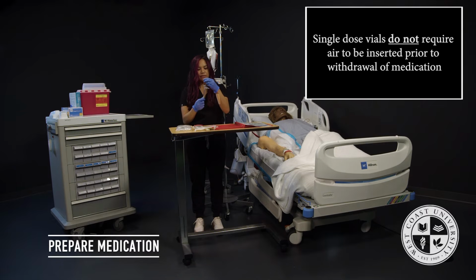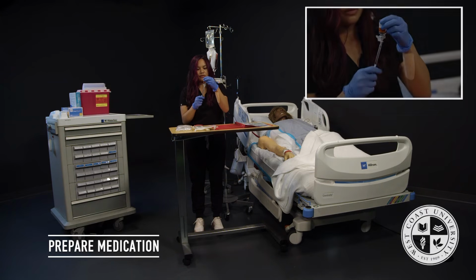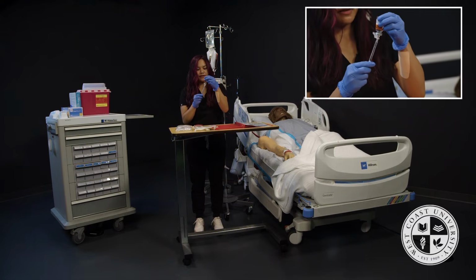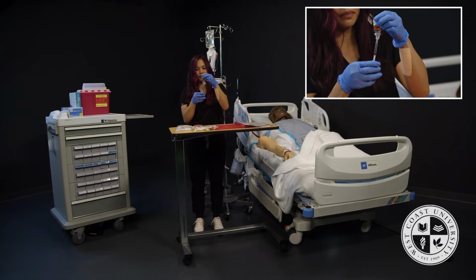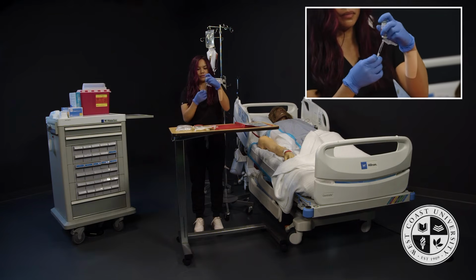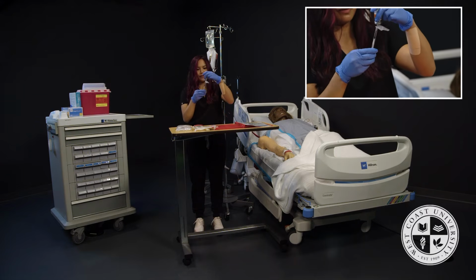Since I have completed my Med Check 3, I'm going to use this time after I draw up the medication to call for a second RN to verify. I'm going to make sure I get all the air bubbles out, which can be tricky. Okay.